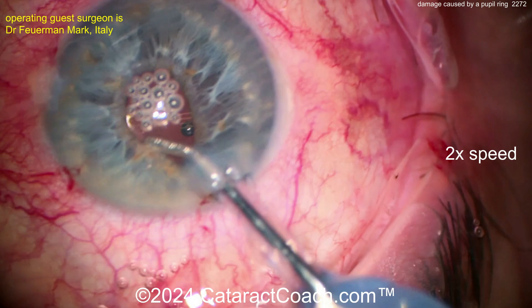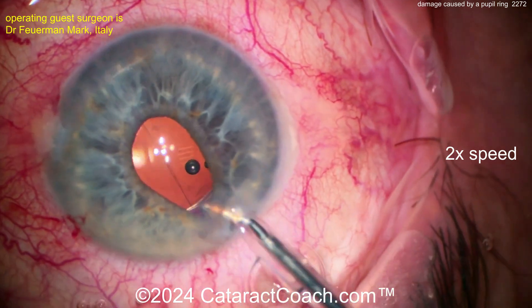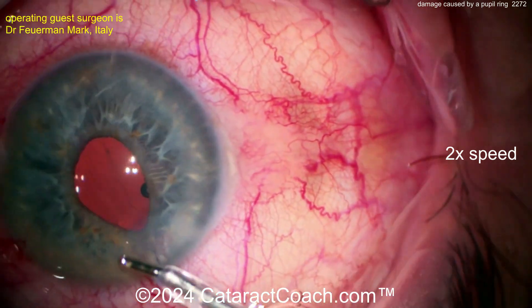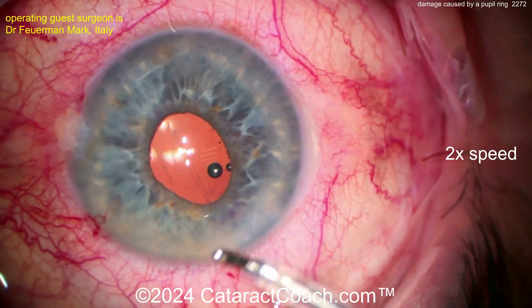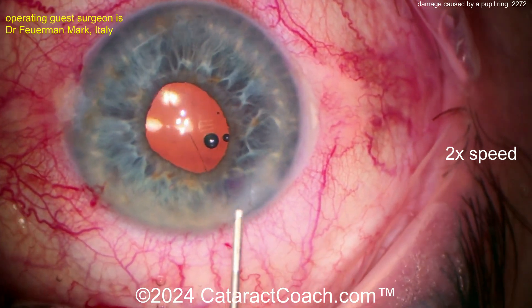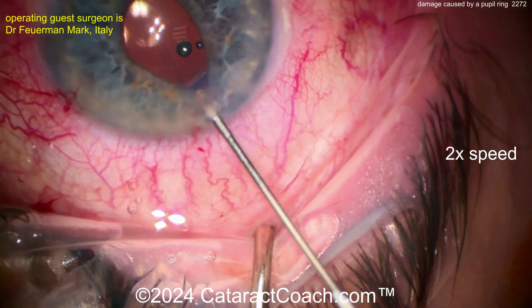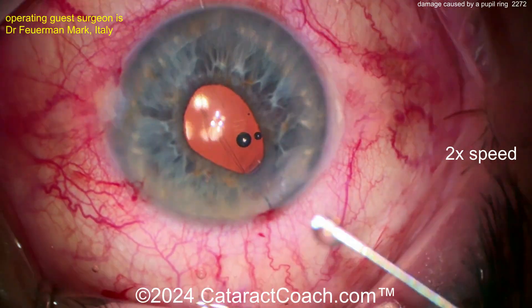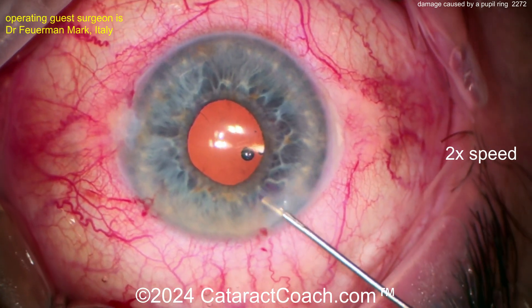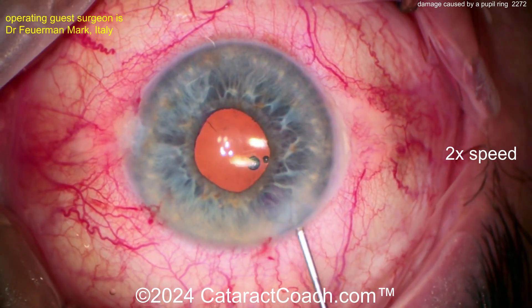We got the ring out of the eye. This is a very floppy iris patient. Don't blame the surgeon — blame the patient for bad protoplasm. Remember this important lesson: if you see a patient who had complications of surgery in one eye done elsewhere, and the other eye has still yet to be done, and you think 'for the second eye I'll do a much better job' — take it easy. The second eye is going to have the same issues as the first eye. Give the first surgeon the benefit of the doubt.